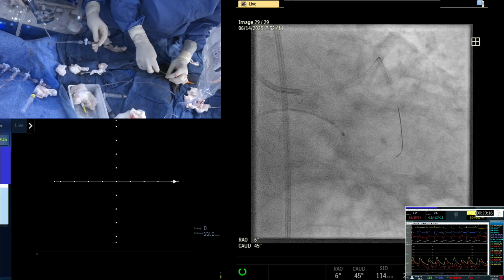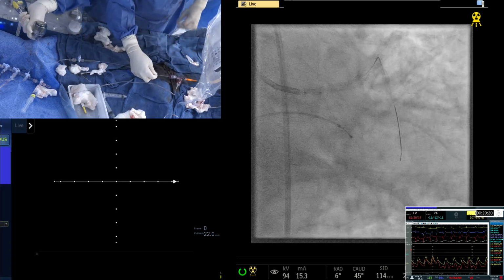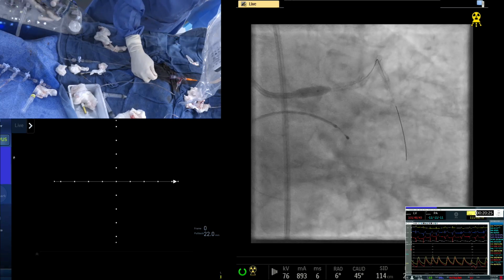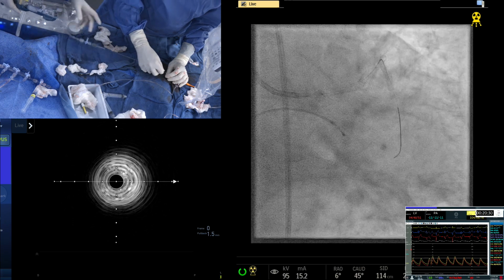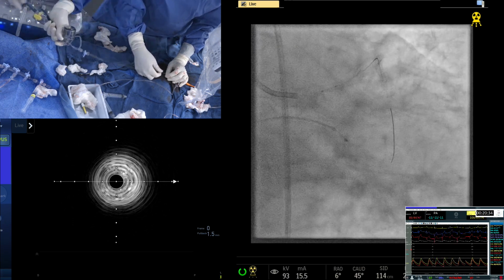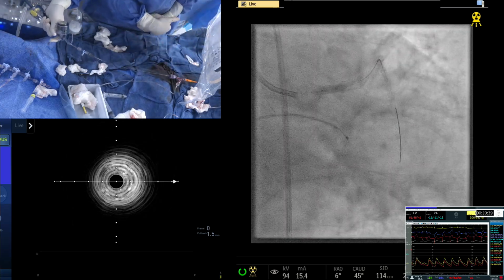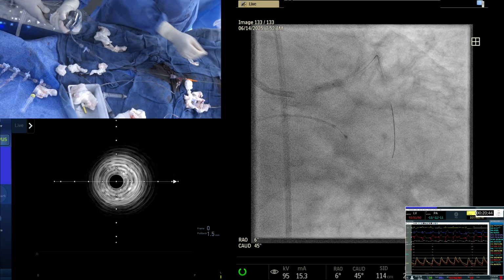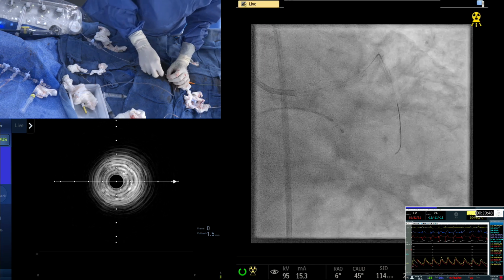Dr. Kinney, what is your practice? Before POT, you remove the side branch wire, or you still keep it? No, remove it before. Yeah, you remove it. And then EBC says the other way actually. I know. EBC says now you recross and do a kissing. In every case in EBC there was a kissing, and that's why they call it a stepwise provisional. Although 23% require a second stent. Rare situation, remember you can have your wire just stuck behind the stent. So always remove it and then recross. That's what I would do.